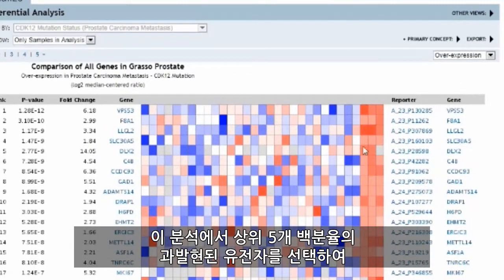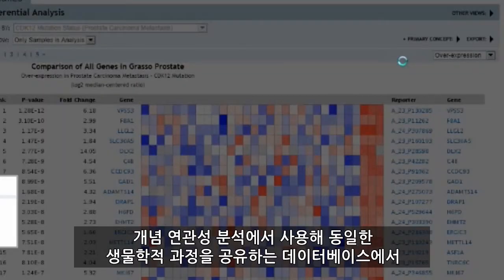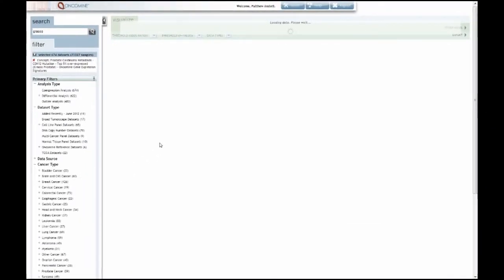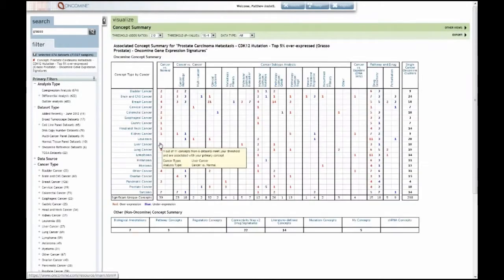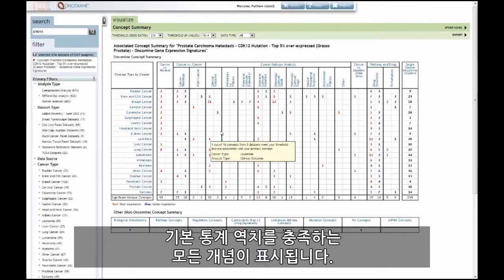We can select the top 5% overexpressed genes in this analysis and use these in a concept association analysis to identify other concepts or gene lists in the database that share the same biology. The resulting concept summary map shows all of the concepts that meet the default statistical thresholds for similarity to our primary concept.